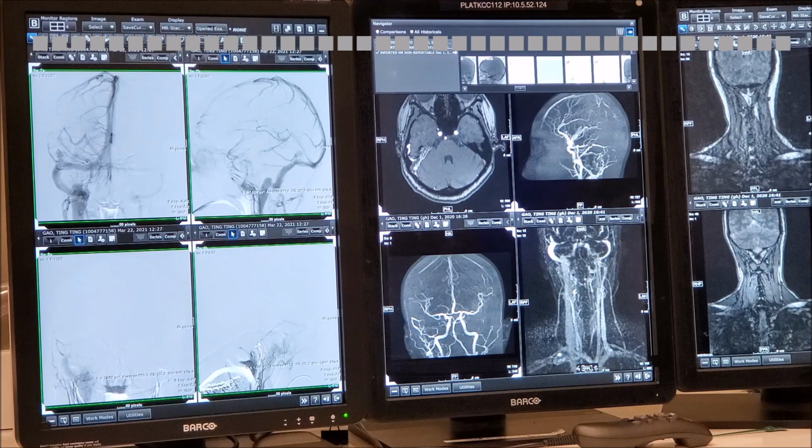So here you also see another important thing of imaging. Okay, what's going on here? What's happening here? The patient is moving, like swallowing. Swallowing, yes. The head is not moving, look, right? Yeah. The head is very nice. You see something here, and you see the jaw move. So it's swallowing.